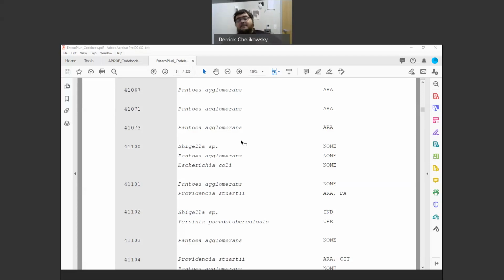That's just an example. But part of this identification and part of your rationale is also thinking, does this make sense? And if it makes sense, go with it. If you get to the point where you have two different bacteria that are similarly sensical, so you can't identify them, that's perfectly fine. Other tests would need to be done, which are beyond the scope of this course.